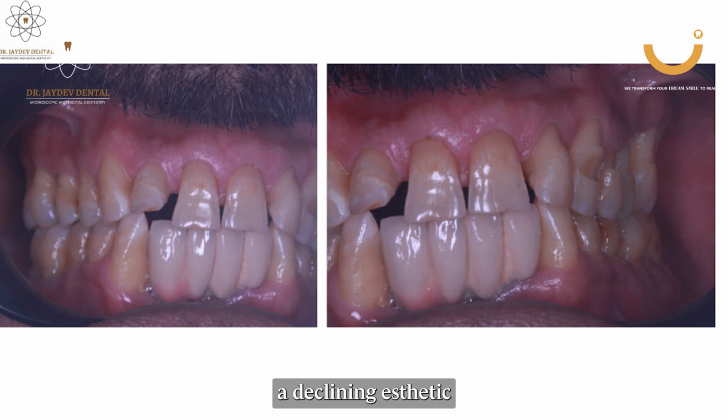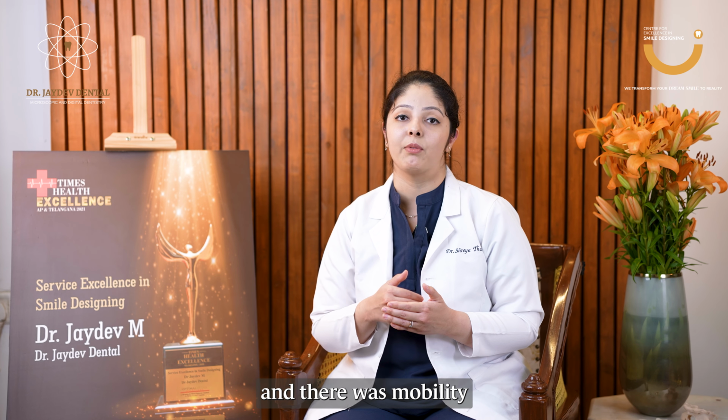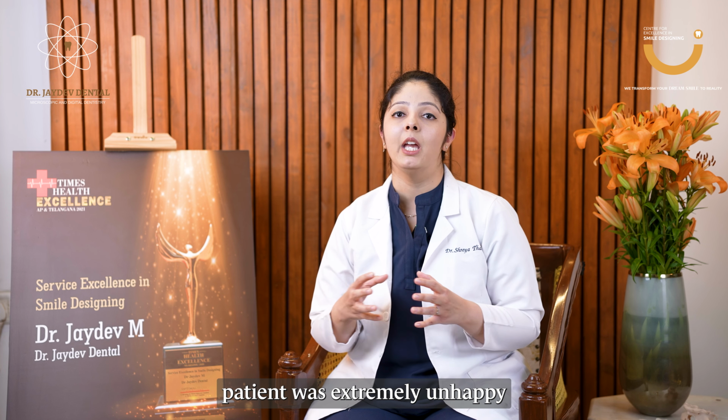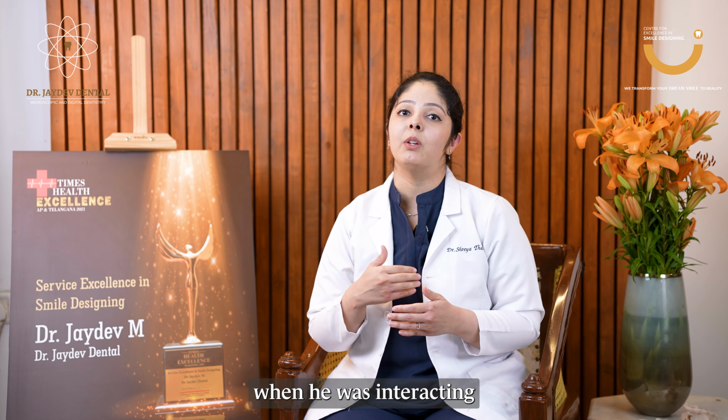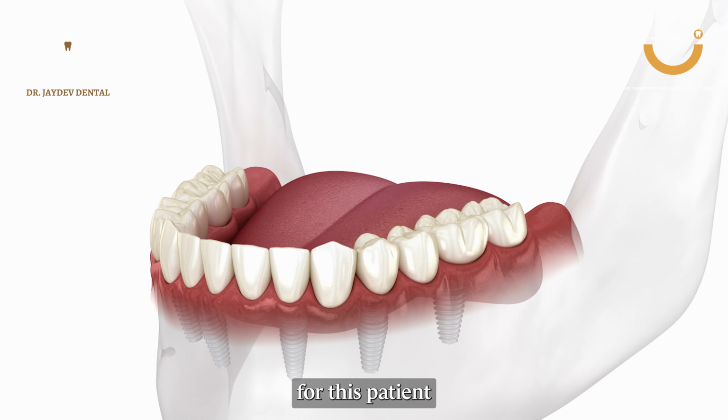Upon examination, this patient reported a declining aesthetic nature of his teeth. There were gum recessions, there was mobility with his teeth, and the patient was extremely unhappy with his smile. He was extremely self-conscious when interacting with other people. So we decided to go for an all-on-6 approach for this patient.